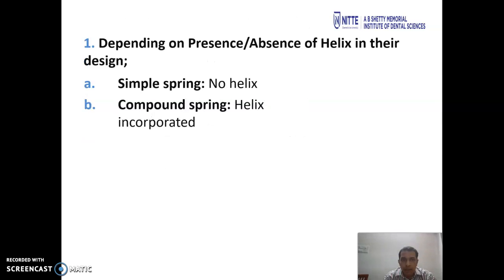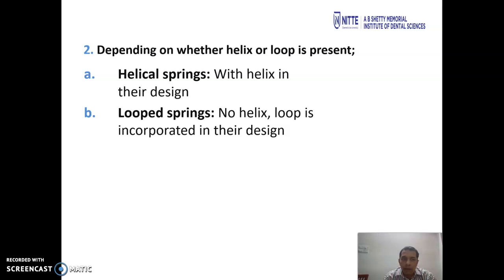Depending on the presence or absence of helix in their design, we have a simple spring with no helix and a compound spring with a helix which is incorporated. Depending on whether a helix or a loop is present, we have helical springs with a helix in their design and loop springs.